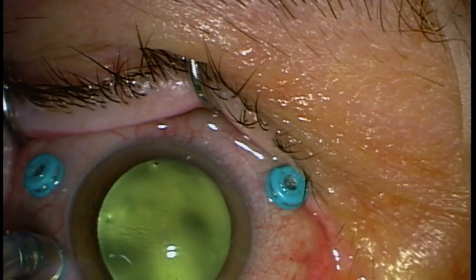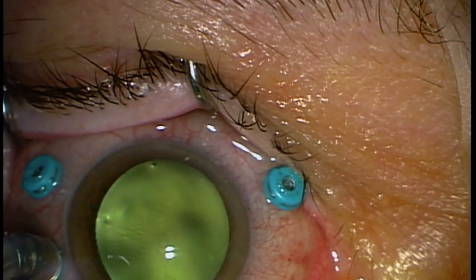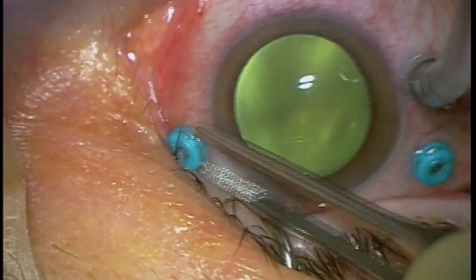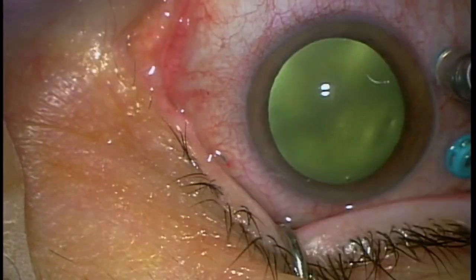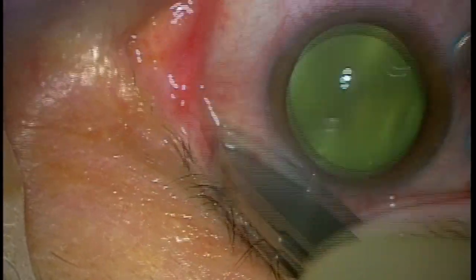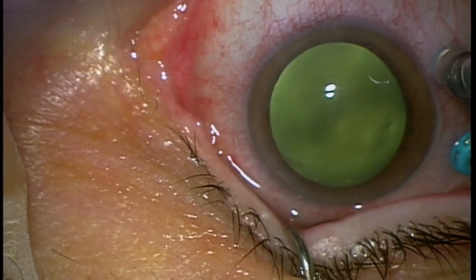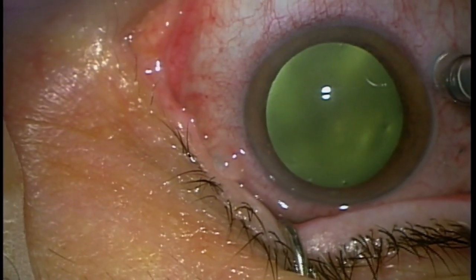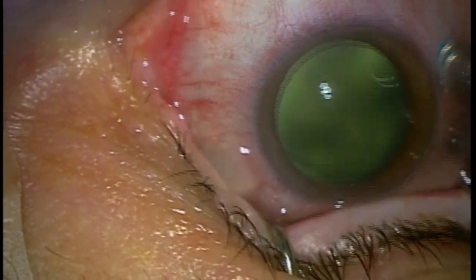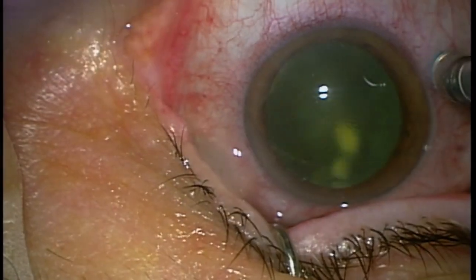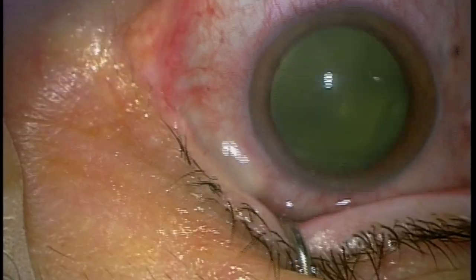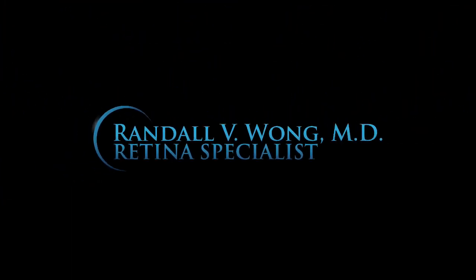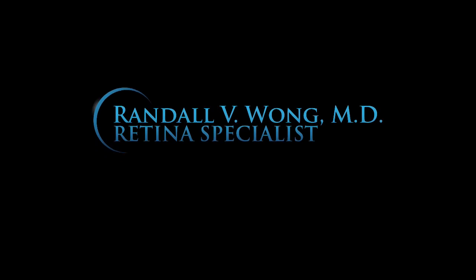We take off the contact lens, which allows me to magnify images inside the eye. I'm going to remove the trocars, which are the conduits that allow me to safely introduce instruments into the eye. Then the last thing I remove is the infusion cannula. You can see the medicine swirling around in the eye. After the trocars are removed, a patch is put on. No stitches are needed for this system.